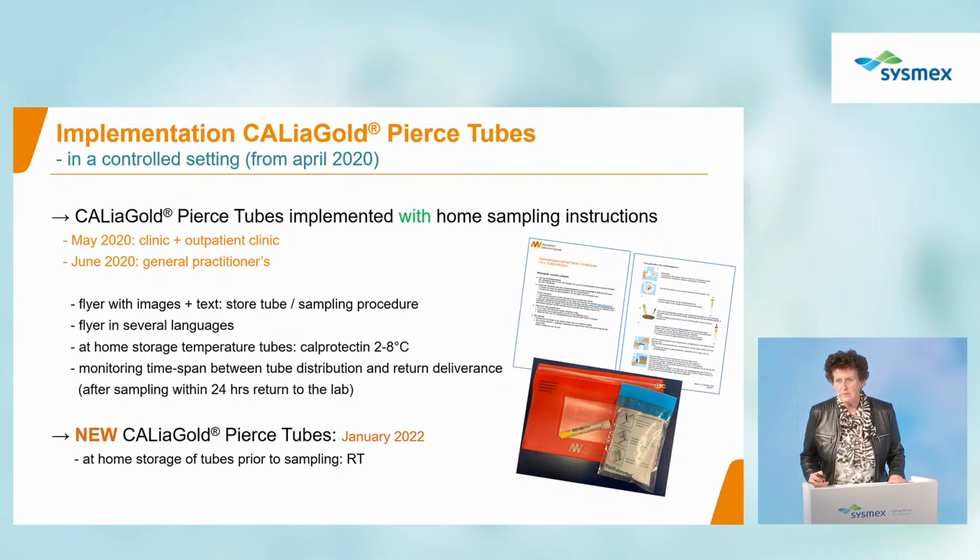So we said, well, when we perform the test at home, the stool sampling must be done in a very controlled manner. So we provided some instructions with a clear instruction folder on how to sample at home, with very clear images, which is also very friendly.